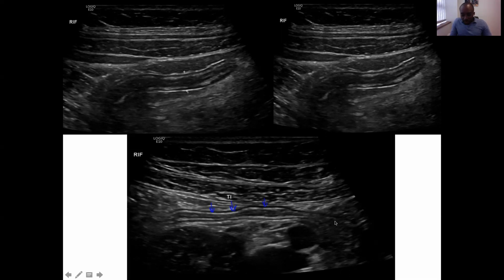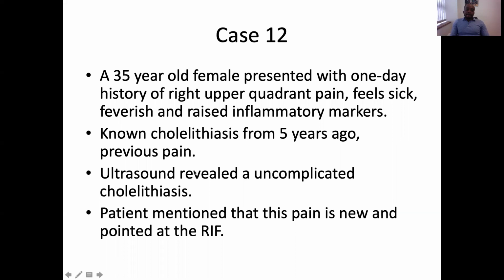You can see where it's continuing from the distal ileum there, and then it continues into the cecum there and there. So you can see that that's a normal terminal ileum, but a marginally inflamed appendix. A normal appendix is 6mm and below, and this was 7mm. So yes, it is inflamed, but not complicated.